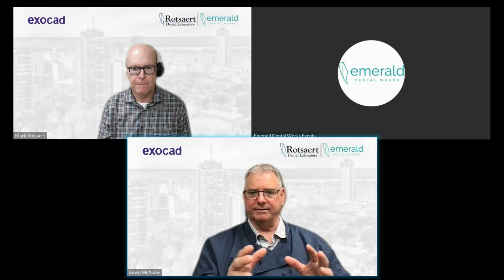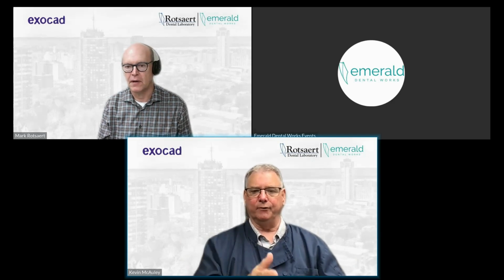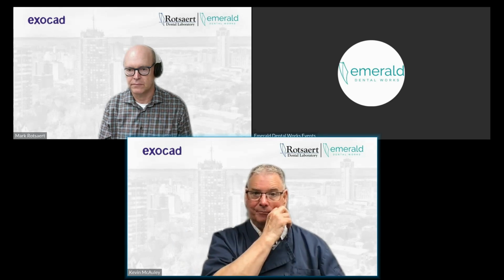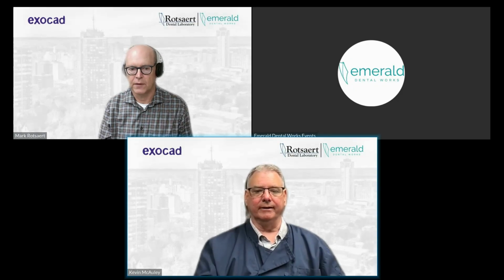Yeah, good question, Mark. The surgical kits, they vary. They really do, and we're not a distributor of those surgical kits. They would come directly from Straumann, Nobel, whatever company you're working with, they will sell you the kit. They rarely lend them unless it's a trial of a new system for you. And usually the drills are single use as well, so that needs to be ordered. When it comes to the sleeves, we take care of that portion of it. But no, you will work with your implant company for any of the unique or specific implant components.